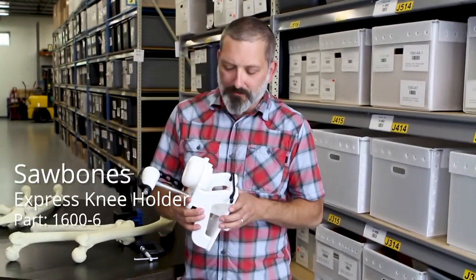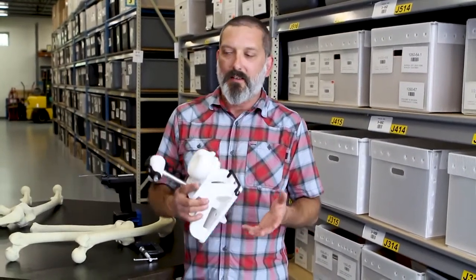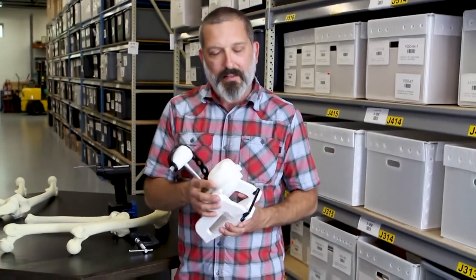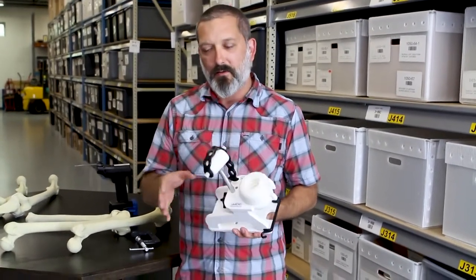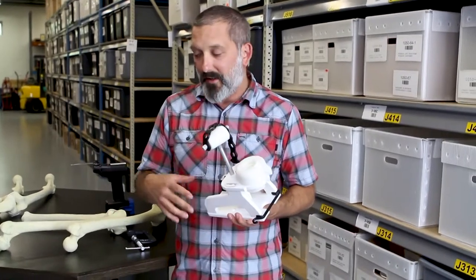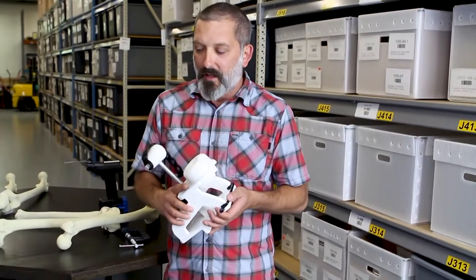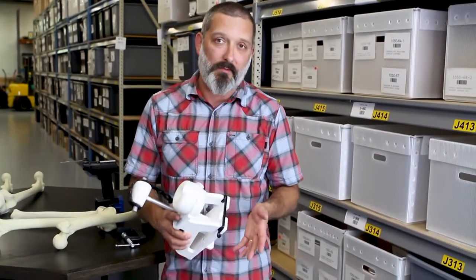We created this model after meeting with several customers, workshops, and other meetings. There seemed to be a big demand for a knee holder or knee system that would take up very little space, be easy to transport, easy to store, and set up quickly and take down quickly for demos.